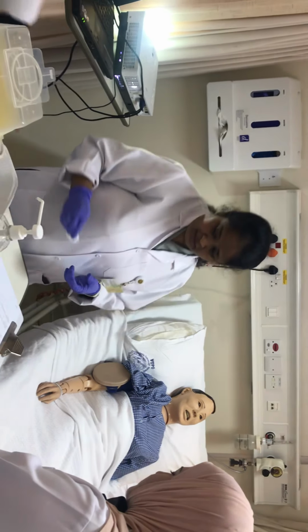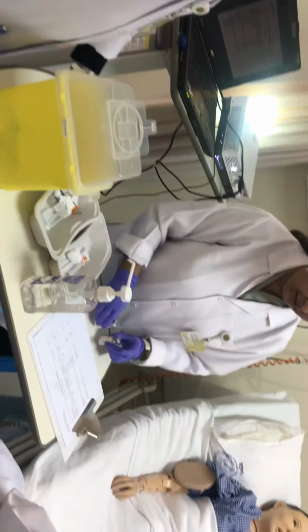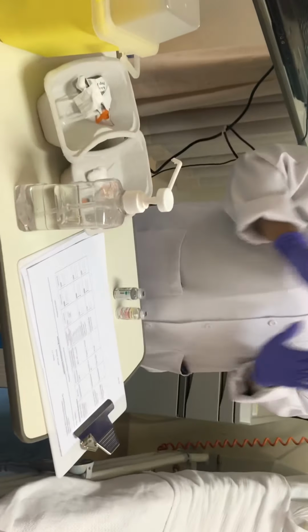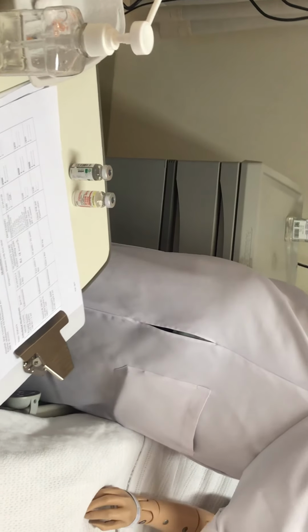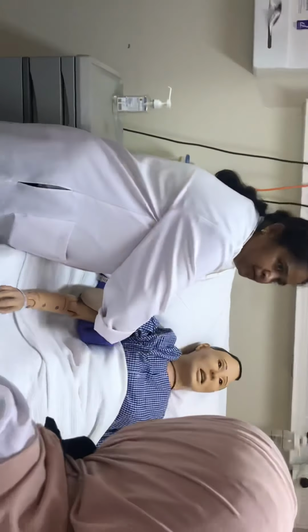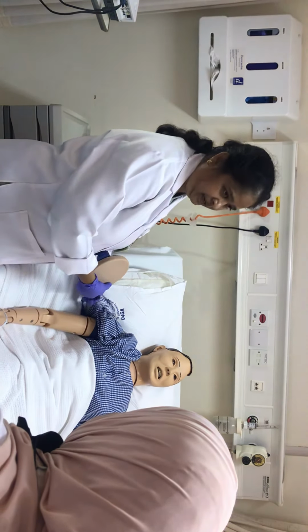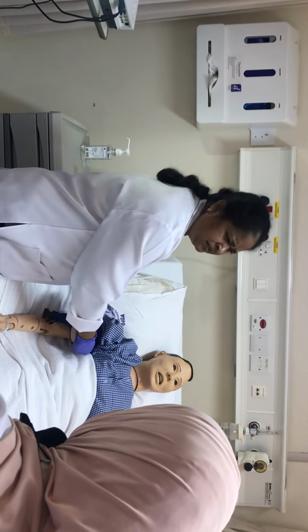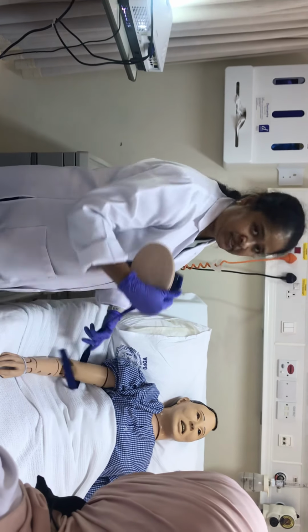Okay, imagine now two I need to give. Okay, I am not following all the procedures. Follow everything else the same. Do you want me to show it in the abdomen? Yeah? Abdomen always 90. You need not think of 45 at all. Only in the hands, we should think whether we need to give 45 or 90. Even a thin person will have enough subcutaneous fat in the abdomen. Yes, so always 90 degree. Okay.